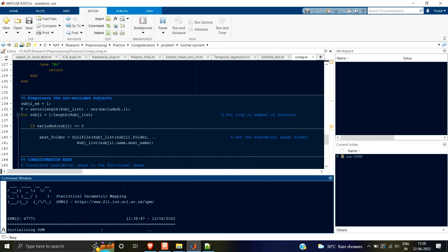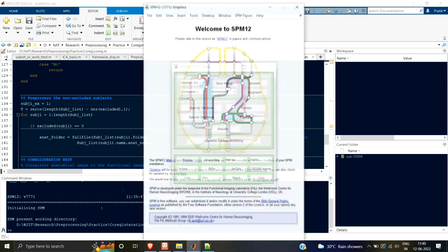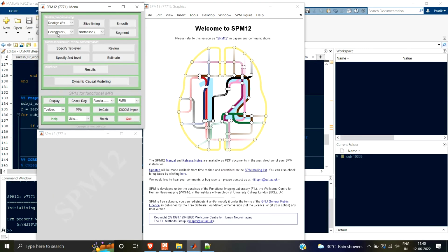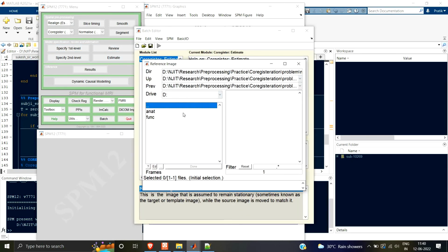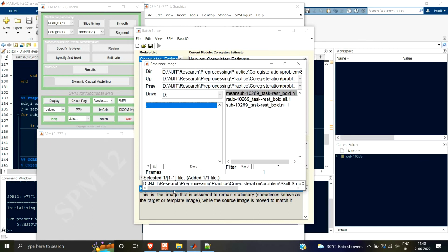So let's go to SPM for that. Co-register, estimate, reference image. So let me put the AFNI image over here. Oh, I'm in the wrong directory. AFNI image, the rest image. Oh, sorry. You just have to put the reference image over here. So I've done that. So the anatomical image is the reference image.